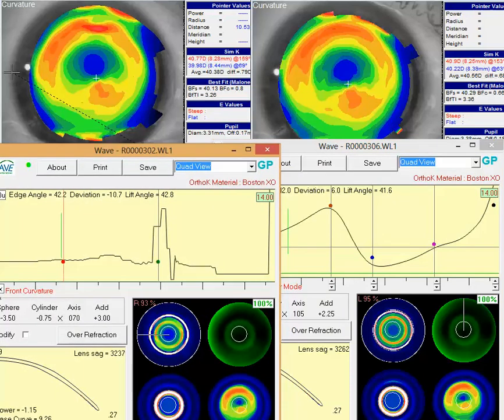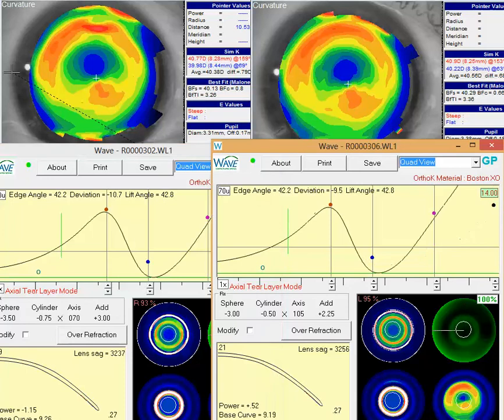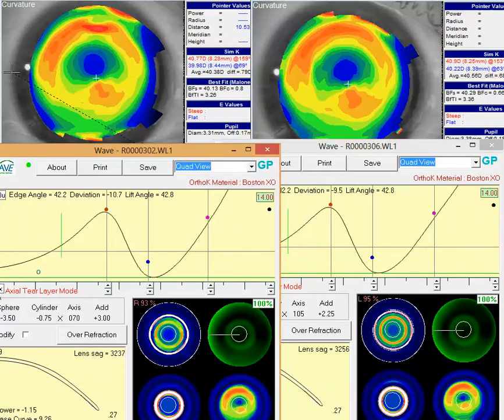So with that said, I think you're pretty close on these designs. Actually sounds nice. Just to summarize, I would put the spherical overrefractions in and adjust for that. Assuming the fit is acceptable physiologically, I don't think I would change a whole lot with that, and then go from there.